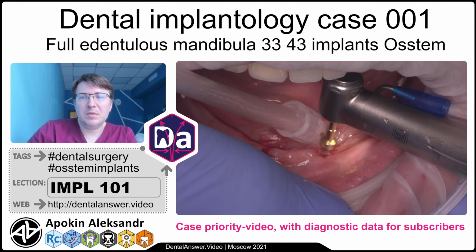Very small bleeding, very small incisions. This is a very atraumatic implantation. For the whole patient group, I think this is the best choice. This is the sterile Osstem implant in this capsule. Here it is, the cover. Now we're ready for insertion of this implant. 13 mm long. The mount system.